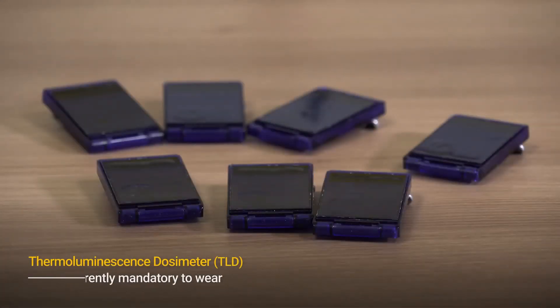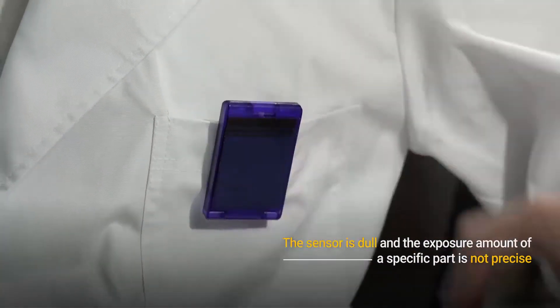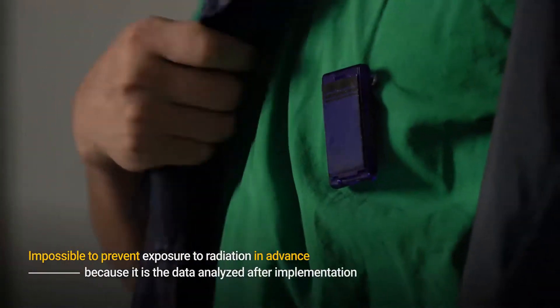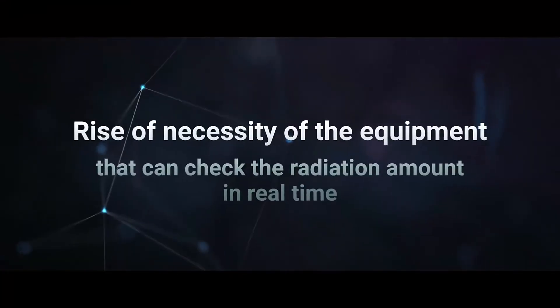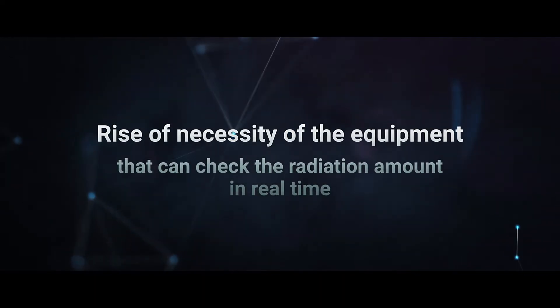Currently, the TLD that is mandatory to be worn has limits because its sensor is dull, the exposure amount of a specific part is not precise, and the data is analyzed after implementation. Therefore, the necessity of equipment that can check the amount of radiation in real time is on the rise.